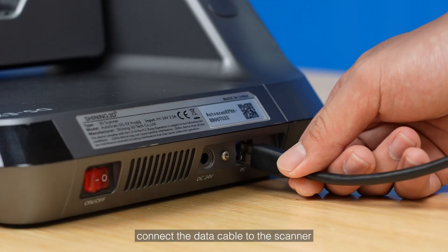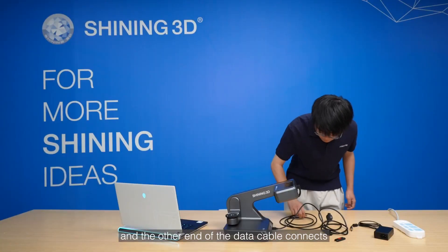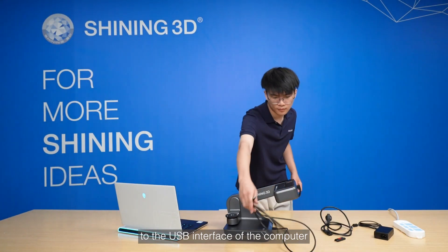First, connect the data cable to the scanner, and the other end of the data cable connects to the USB interface of the computer.